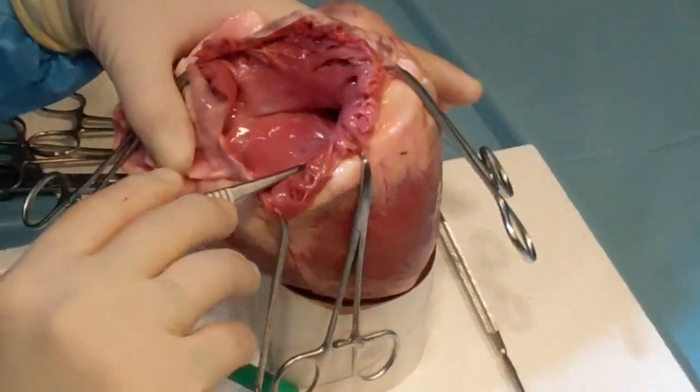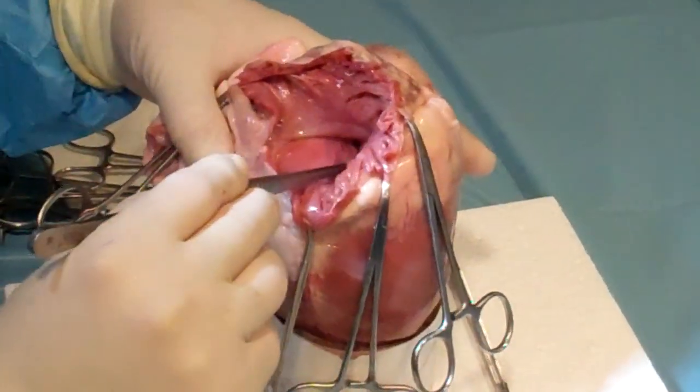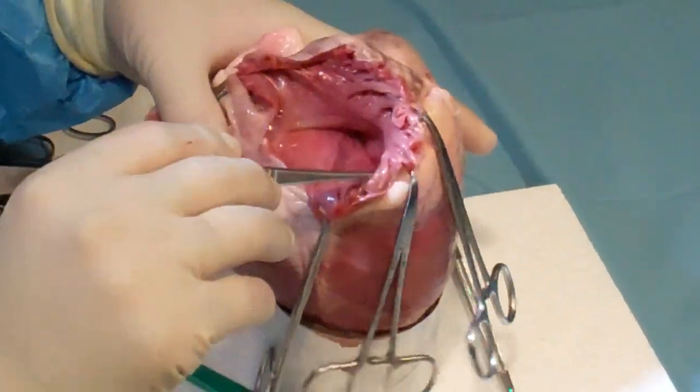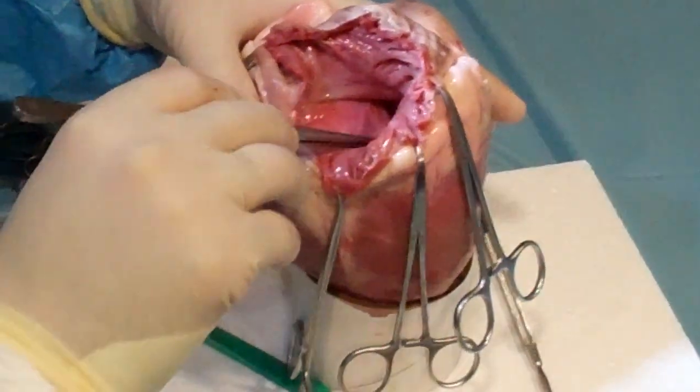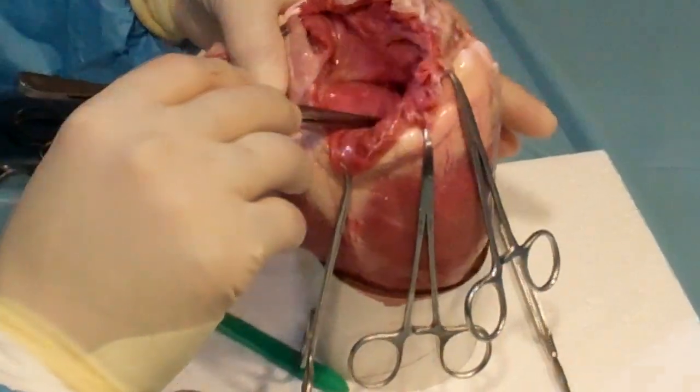And it's going to dilate anteriorly. So through anterior dilatation, if you stick your finger in right here.